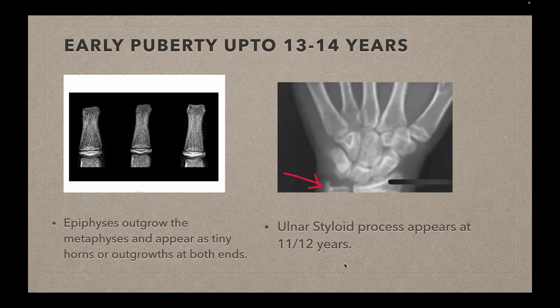The next stage is the early pubertal stage, up to 13 to 14 years. Continuous growth of the epiphysis occurs and it tends to outgrow the metaphysis, appearing as tiny horns or outgrowths on both ends. The styloid process of the ulna appears at 11 years in females and 12 years in males, which can be seen on the x-ray.